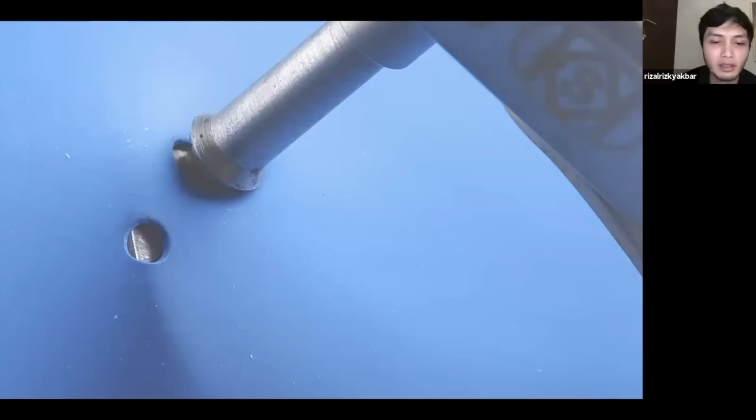I don't know, maybe in the next few years or 10 years, there will be an isolation method better than rubber dam. I don't know. But for now, rubber dam is still the best.